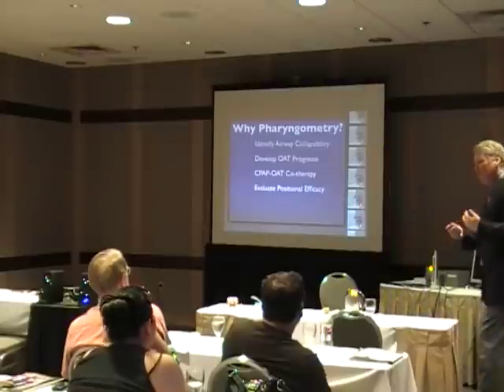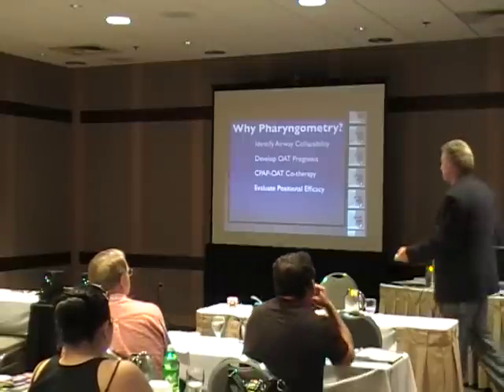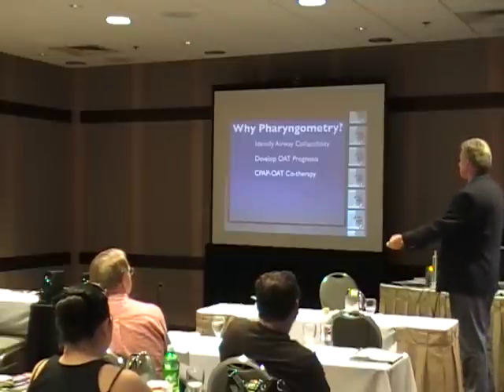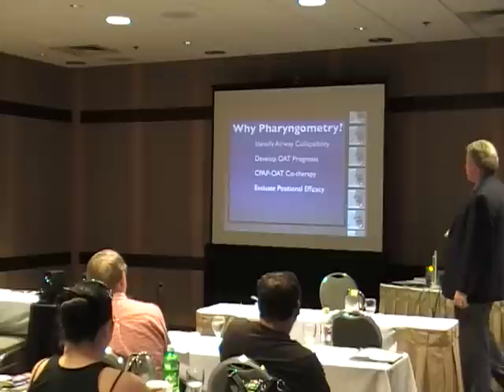And if you've never used the equipment, it's easy to speak negatively about it. Okay? So you can evaluate, but it isn't the end all. Why else would we use pharyngometry? All right, evaluate the positional efficacy.